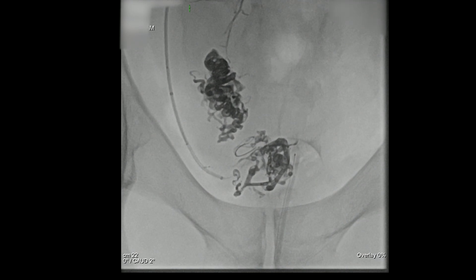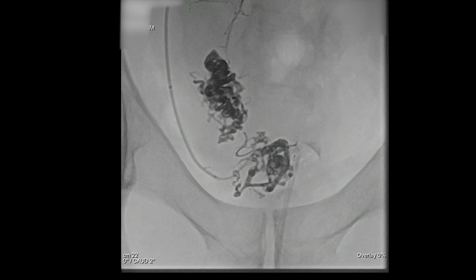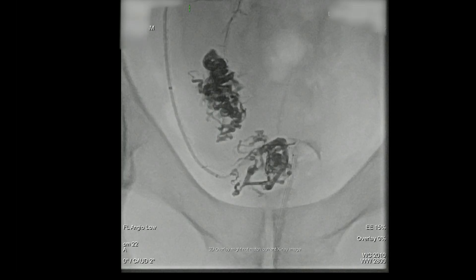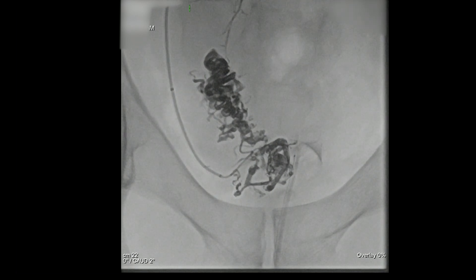Sometimes this process takes a while. It's the process of mapping the target vessels, positioning the microcatheter as distally as we can get it, and then doing the injection. Injecting through the microcatheter, I'm always looking to see where the onyx could end up that you don't want. It really lets you see how tortuous and convoluted these vessels are.